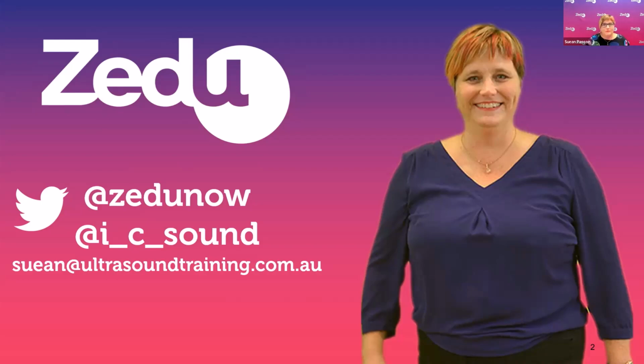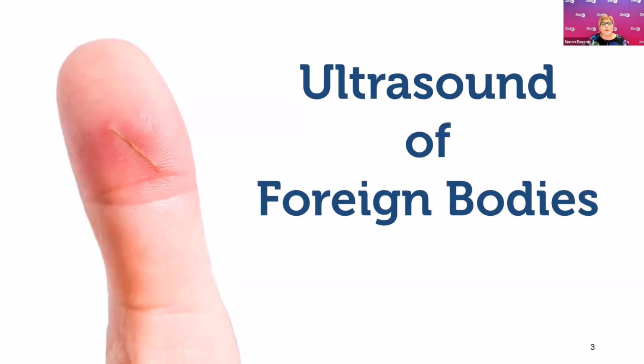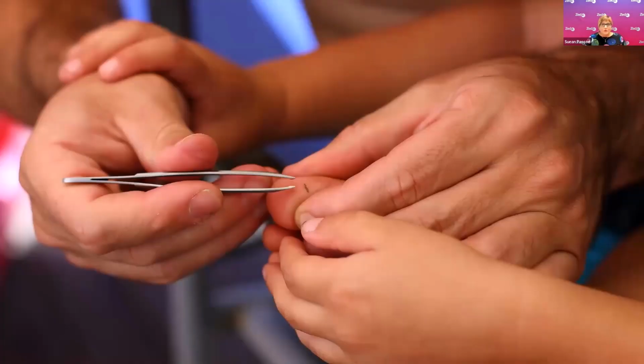So without further ado, we're going to look at ultrasound assessment of foreign bodies. Retained foreign bodies are a common and frequently complicated presentation in both the emergency department as well as GP clinics. Whilst they are usually quite superficial, they can be missed very easily, even when a well-trained clinician performs a thorough history and physical exam. If you don't find them, they can lead to inflammation, delayed healing, and damage to the surrounding tissues. Organic objects such as thorns, splinters, and spines can cause severe inflammation, hypersensitivity reactions, and even infections which are resistant to antibiotic treatment and require surgical removal as the only definitive treatment.